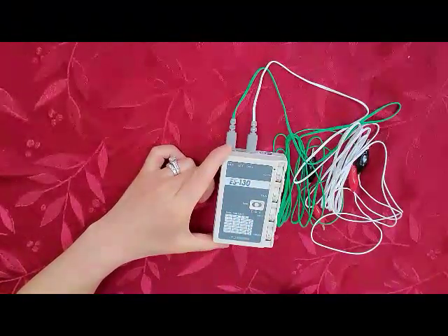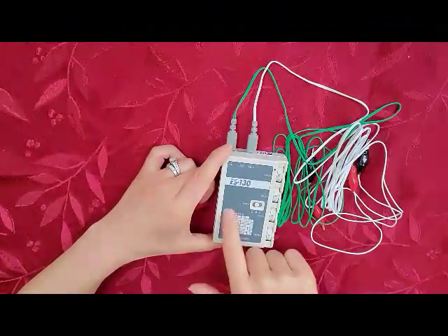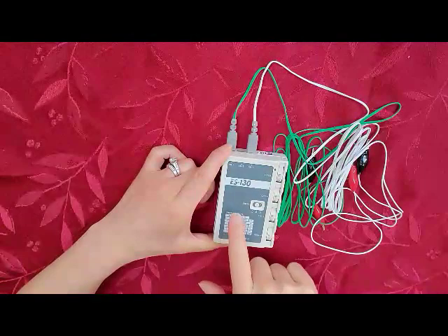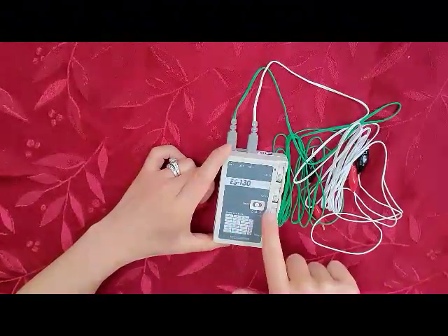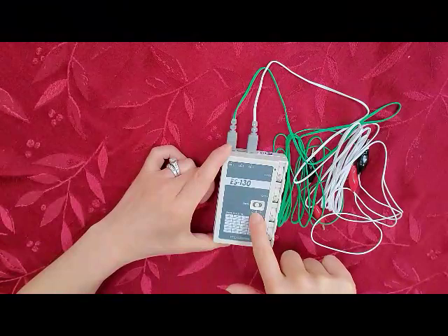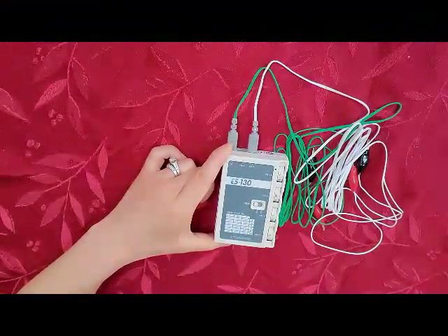If I wanted to set this electrostimulator at a setting of 2 Hz, we would look at the frequency table at the bottom. If we notice, the frequency of 2 Hz is going to fall between 1.5 and 2.5 in the L column. So we want to make sure that our unit is set to L. So we need to move this tab over to the left to the L setting.